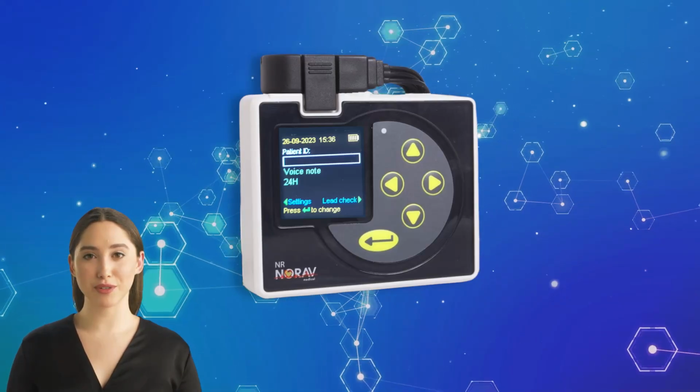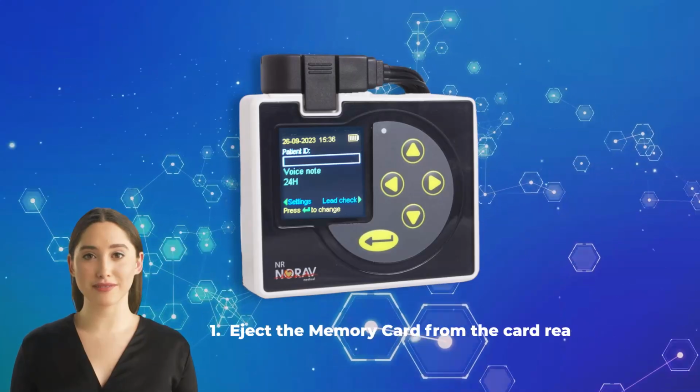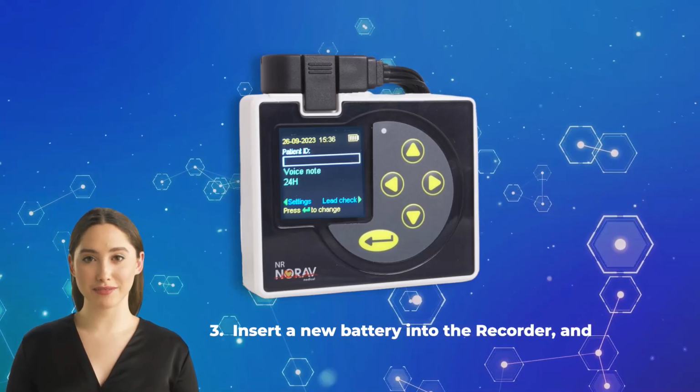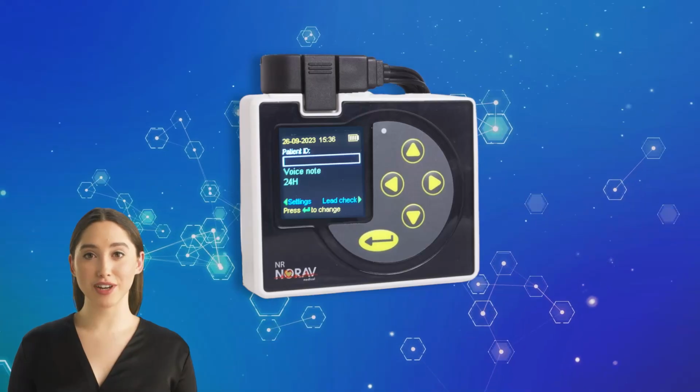If you have prepared your recorder using a memory card reader, eject the memory card from the card reader. Insert it into the recorder of the prepared patient. Insert a new battery into the recorder and turn it on. Make sure the recorder screen is turned on. Now we need to verify the recorder data.